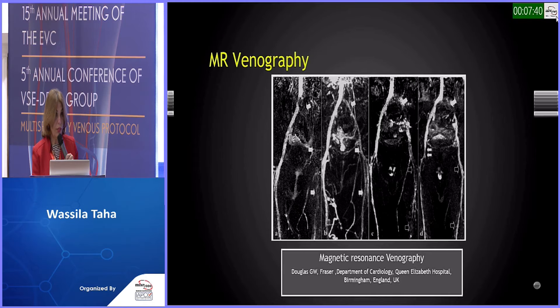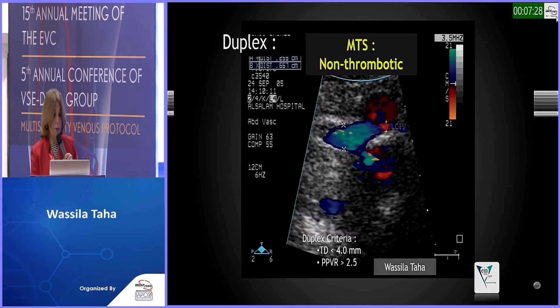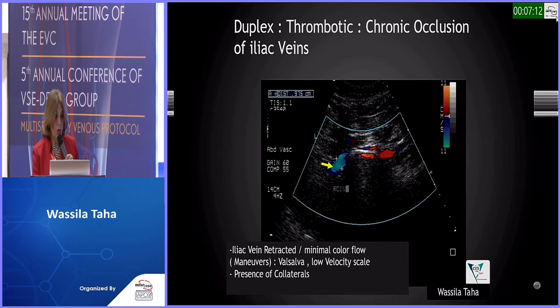This is MR venography showing left iliac vein occlusion. This is CT venography beautifully detecting May-Turner syndrome, where the left common iliac vein is compressed by the right common iliac artery. Here by duplex, we see the proximal left common iliac vein compressed by the right common iliac artery, and even the collaterals around the tight stenosis are depicted. This is a chronic iliac vein occlusion — the left common iliac vein is thread-like with very minimal color flow.